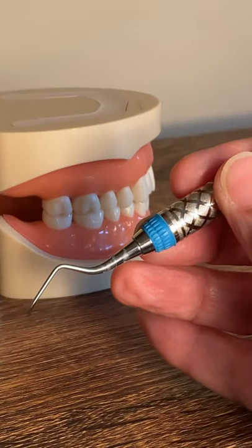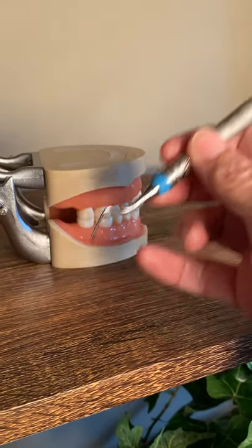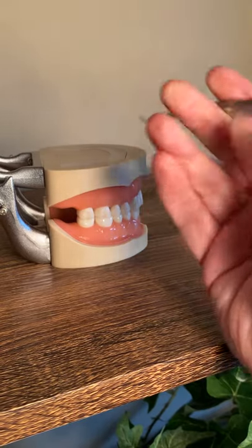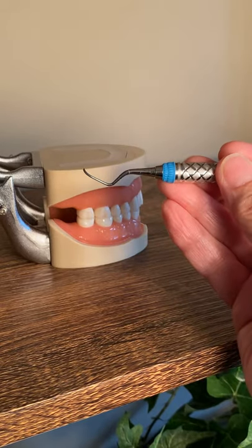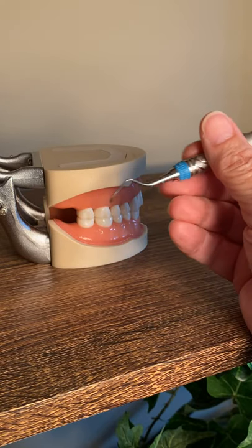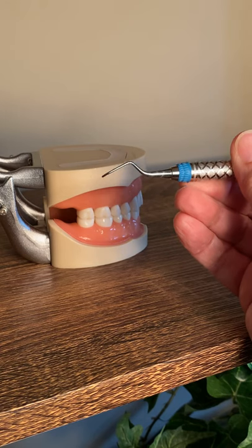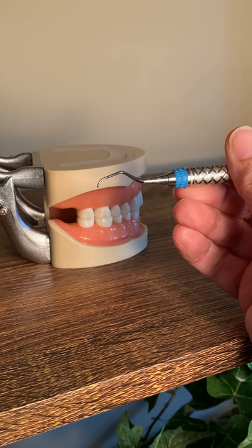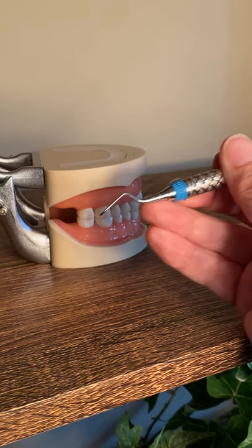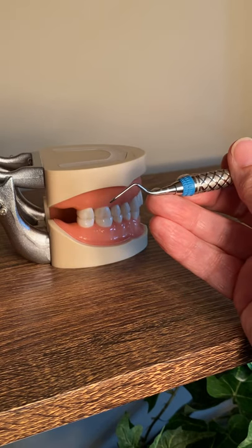Let's look at the universal curette and talk about advanced instrumentation. This is the Barnhart one-two, which you use in first year. It can be used posterior or anterior. The beauty of a universal curette is that it can be used anywhere in the mouth, so you can do the whole mouth with this one instrument without constantly changing it out from mesial to distal.